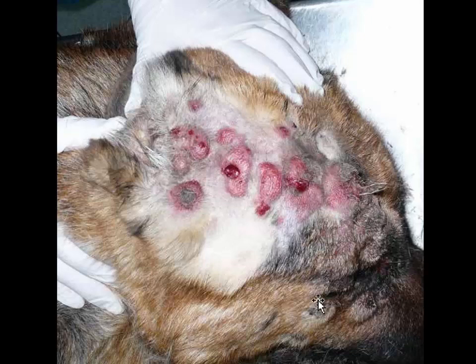But one of the clues that I see with epitheliotropic T-cell lymphoma, used to be referred to as mycosis fungoides, is that you always see one or two of these areas which have the shape of a donut. They have a depressed center. It is really a rim of infiltrated neoplasm. I have no idea why they look like this.